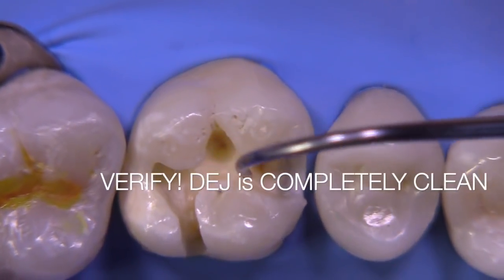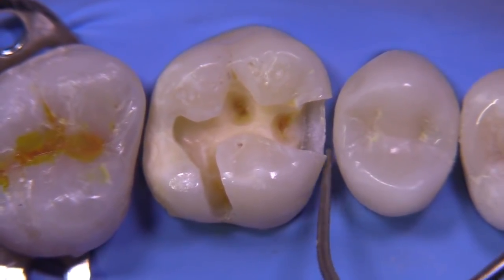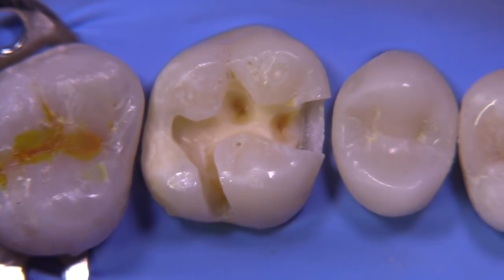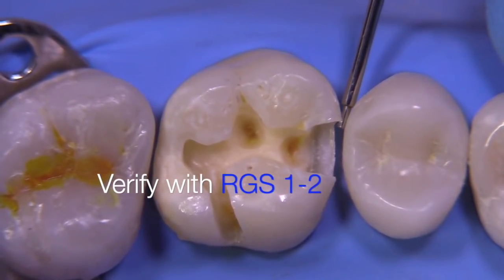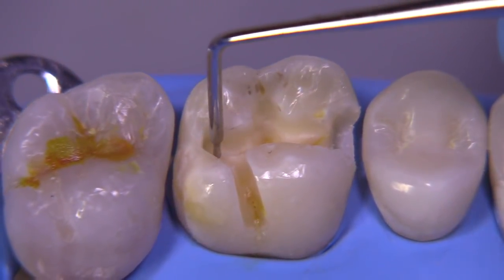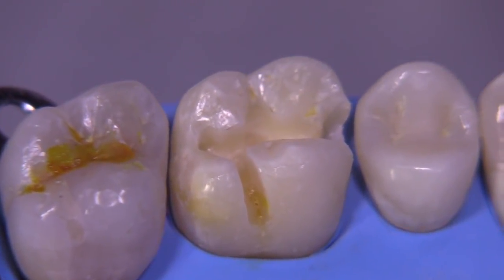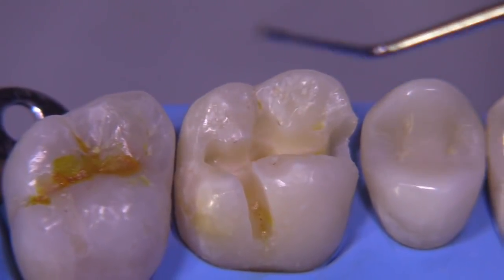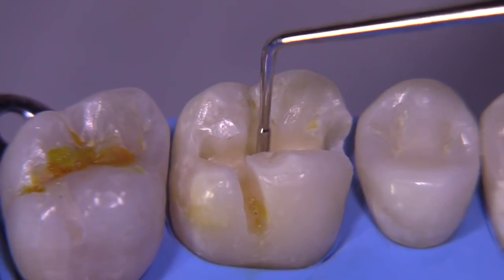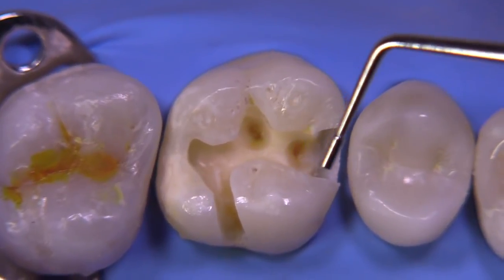It's important to verify that the DEJ is completely clean all the way around. Look up underneath the cusps, look at the DEJ in all locations. Studies have shown that the most common area to leave caries behind is underneath cusps — and that was true whether you were a student or a faculty member, so it's an area we're all challenged by. The RGS1-2 is used to check your extensions and depth, making sure you have adequate depth. This is a composite so we could be a little less than 1.5mm, but I made it 1.5mm for the demo. The RGS2 measures two millimeters in length and you can see that we're probably 2.5 to 3 millimeters deep in that deepest area of the caries lesion, which is quite a distance away from the pulp.